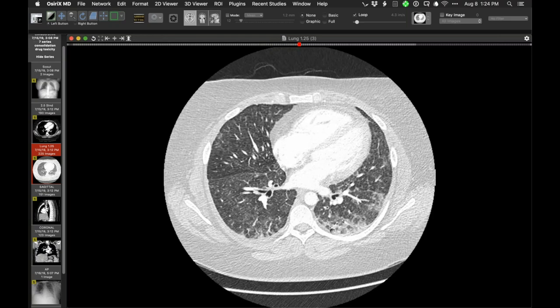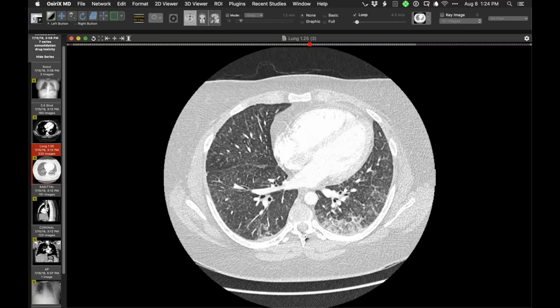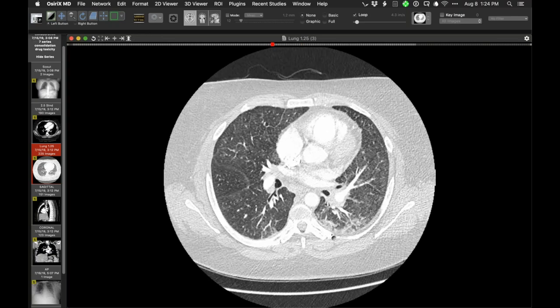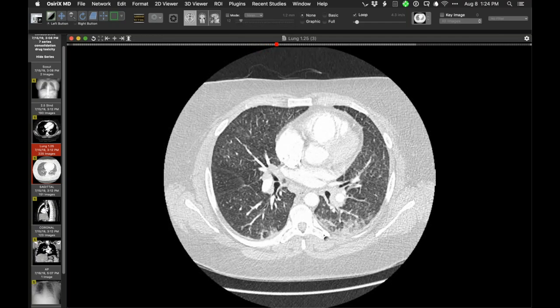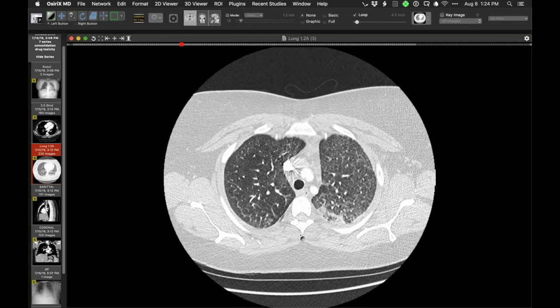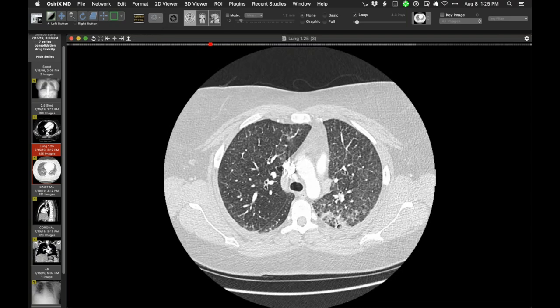So I don't know. Is it a cytokine-mediated thing? Why do people get this? There are all kinds of theories about what is actually going on within the lungs. And if it's eosinophils, eosinophil-associated something, I don't know. But I've heard people use the term lipoid pneumonia to describe it. But I don't think this is lipid. This is not big globules of fat, no.